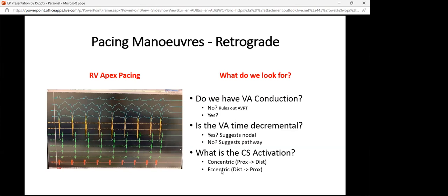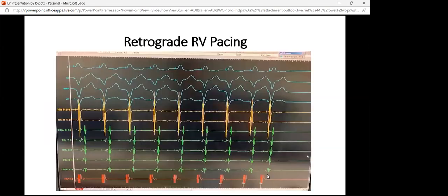Now, as we said before, CS distal is sitting right on that lateral free wall of the mitral annulus. So it's nowhere near the right atrium. It's almost on the other side of the left atrium. So that would be very suggestive that perhaps there is a left lateral pathway if you see that activation in the CS. So we're doing all of this whilst we're doing these ventricular pacing. And again, we're ruling things out and ruling things in as we do that.